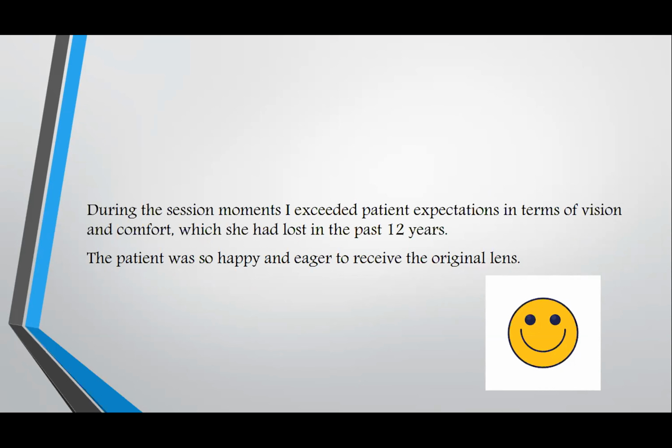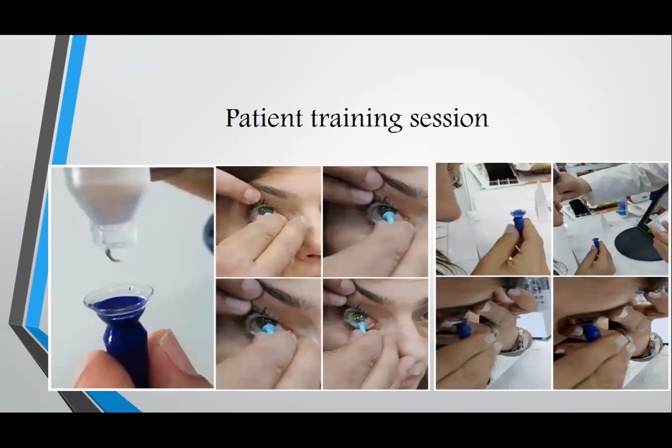The patient was so happy to receive the lens. Finally, we transferred the patient to training sessions to train her how to insert the lens, take off the lens, remove the lens, and the proper solution to use. I would like to make sure of the three most important criteria to keep in mind when fitting these lenses as smart lenses, as a modified generation lens.